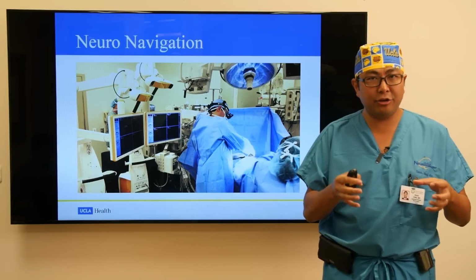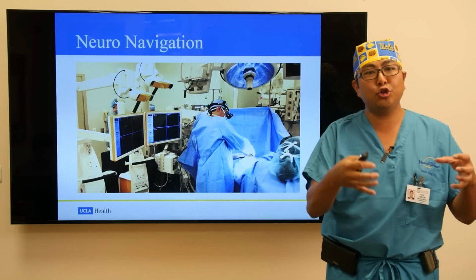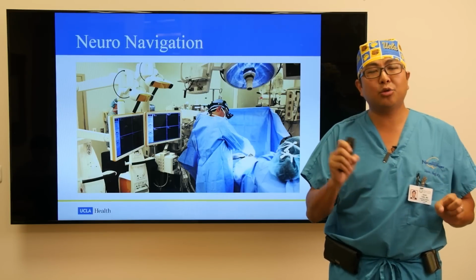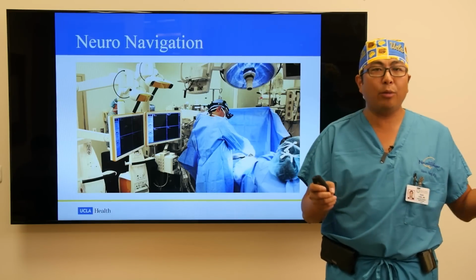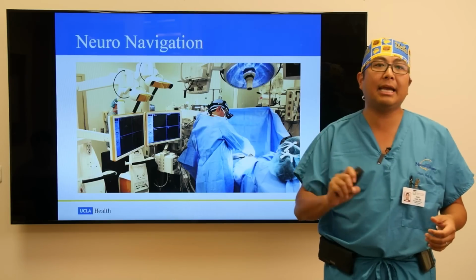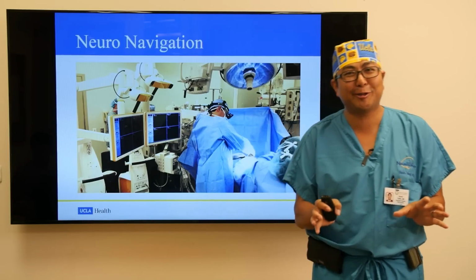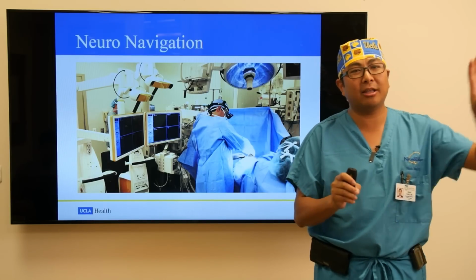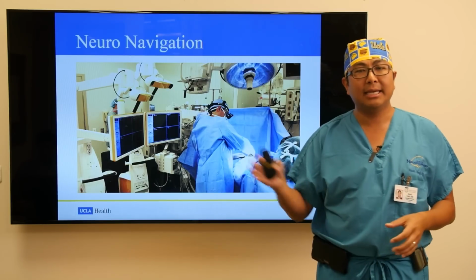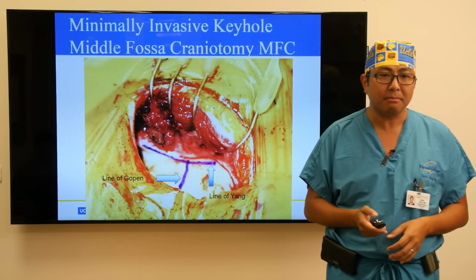And what we have here at UCLA, since we work with BrainLab and surgical theater, is that the two machines and two computers are actually connected to each other. And so we do BrainLab navigation. We also bring in the 3D reconstruction virtual reality, and we can see our wand in 3D recon. We don't put the headset on during surgery. But what we can see is on a computer screen, just like you saw there, where we are in 3D space, in addition to the BrainLab reconstruction that we do for navigation.